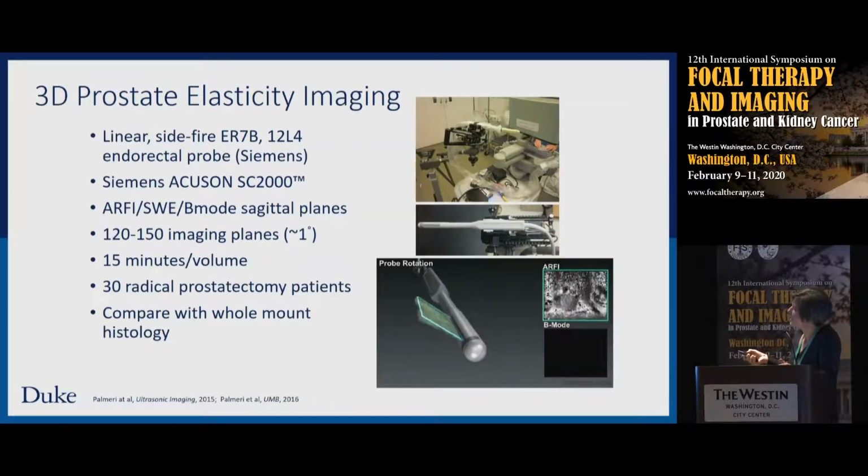Let's see if this will move forward. Yep. So what we do is we take that single point interrogation, and we can do that in multiple positions along a given imaging plane.